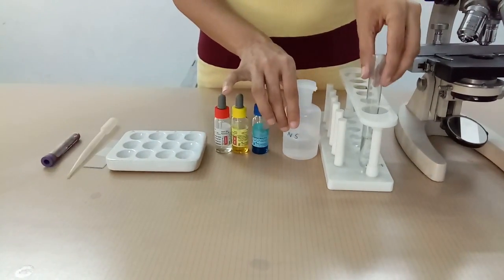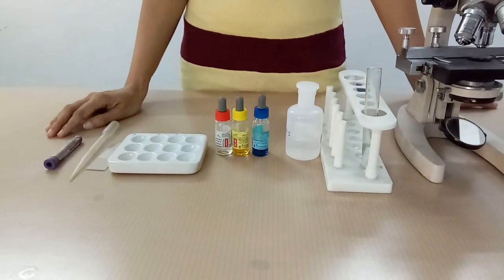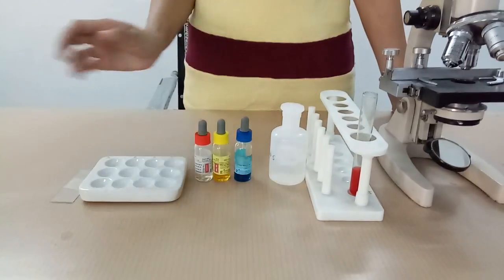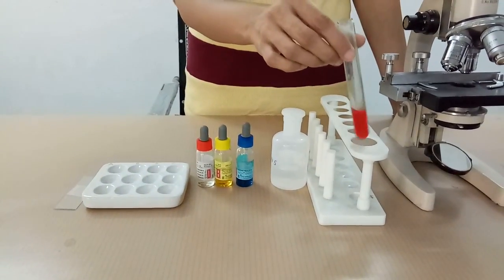Make a sterile finger prick and collect the sample into your test tube. Here we are using already collected sample of blood. Mix the solution to get red cell suspension.